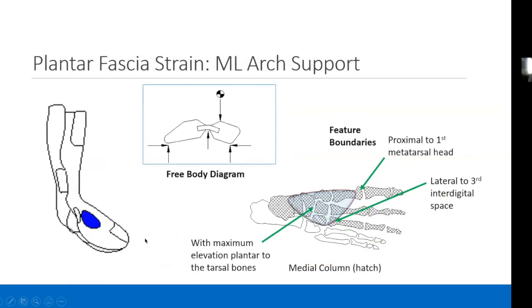And with regard to another supportive element in a supinated foot, we still use, as we all know, the medial longitudinal arch support, and that may be for two reasons. Oftentimes the cavus foot is a more rigid foot, and sometimes it's painful in the plantar fascia, and we actually want to provide support there, even though the arch is elevated, to reduce that pain, to load share, to take some of the force off of those structures.